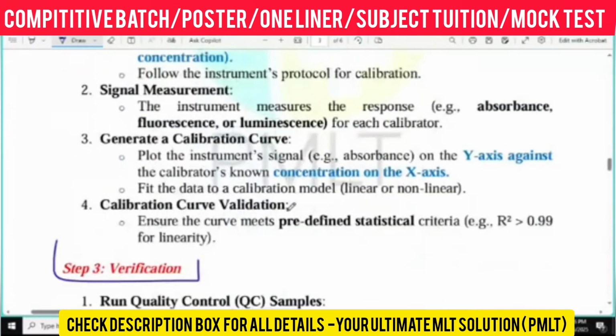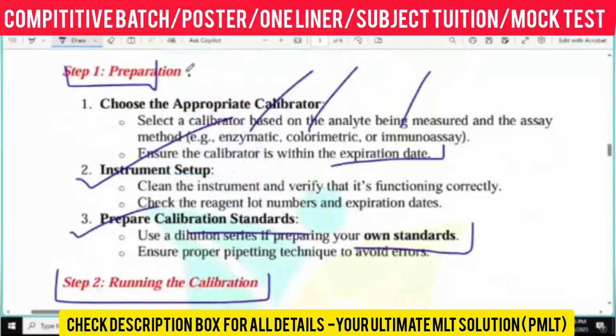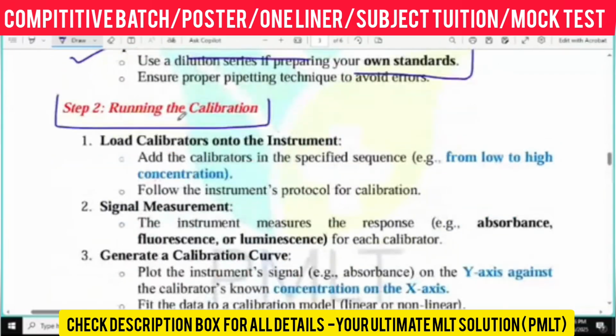Okay. Now I am coming to the calibration. We have already understood the preparation section. Now I am coming to running the calibration. Firstly, we have prepared. Secondly, we have to run the calibration. It's not possible to see these kinds of things on machines because every laboratory has its own machines and its own taste. So whenever you go to a laboratory, you might do these kinds of practical things as well.